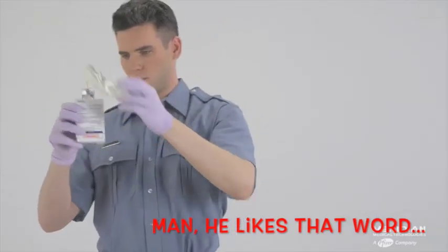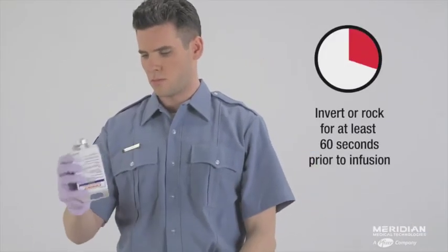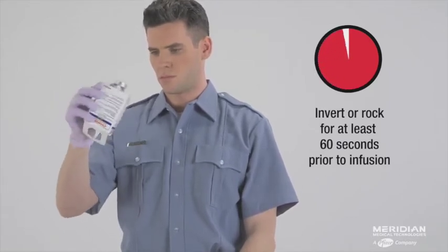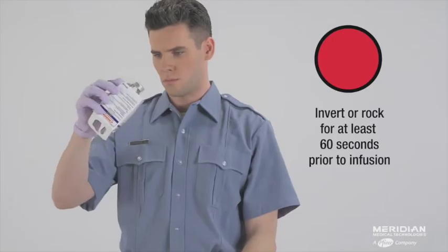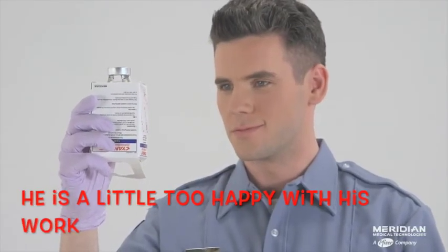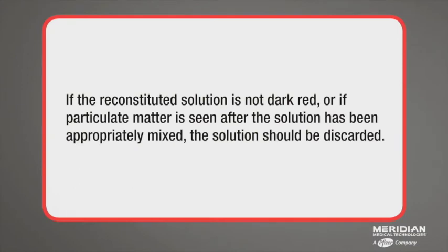Following the addition of diluent to the lyophilized powder, the vial should be repeatedly inverted or rocked — not shaken — for at least 60 seconds prior to infusion. The hydroxocobalamin solution should be visually inspected for particulate matter and color prior to administration. If the reconstituted solution is not dark red, or if particulate matter is seen after the solution has been appropriately mixed, the solution should be discarded.